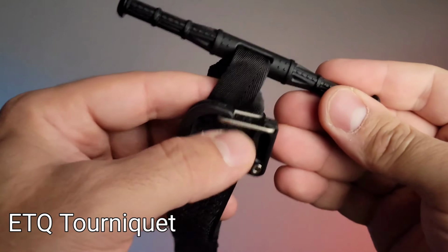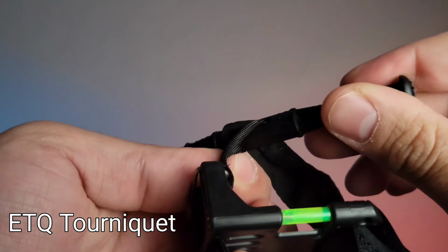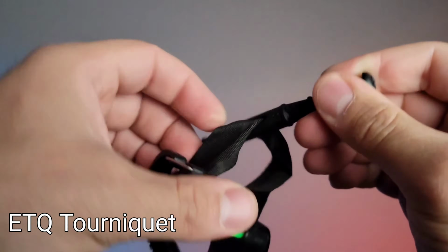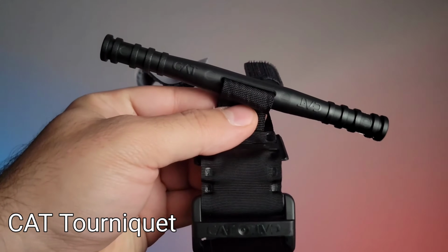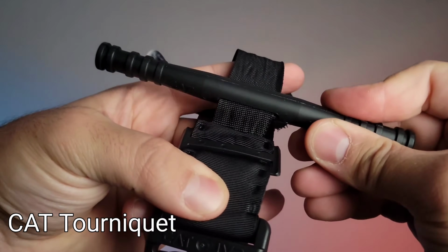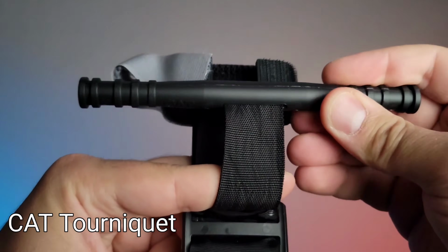is actually has the internal material folded on top of it. So I'm not sure if that's what the design concept for that is, because if I look at something like the CAT tourniquet, you see that it's flat all the way through, so it's easier to see that it's actually level and done properly. So again, I'm not sure of the design perspective on why they did it that way, but as of right now, it's folded over, and you have to, again, twist it in a way that would be beneficial.